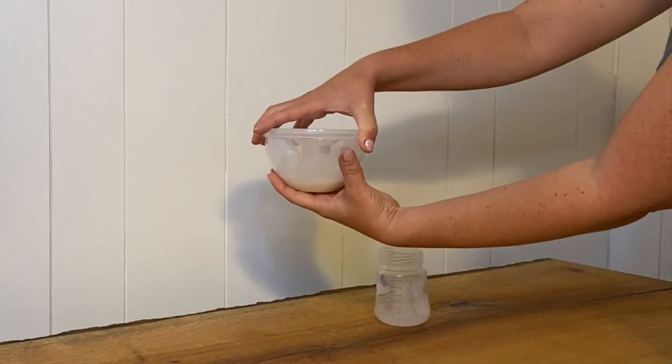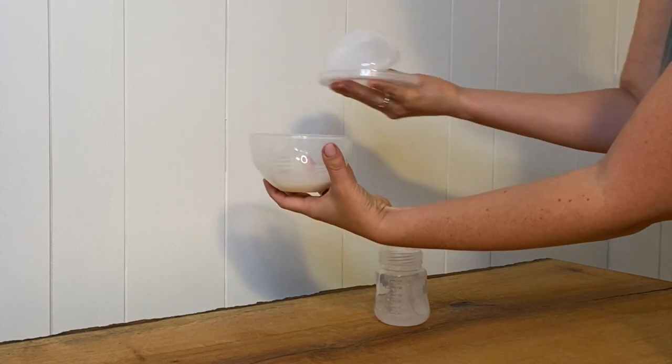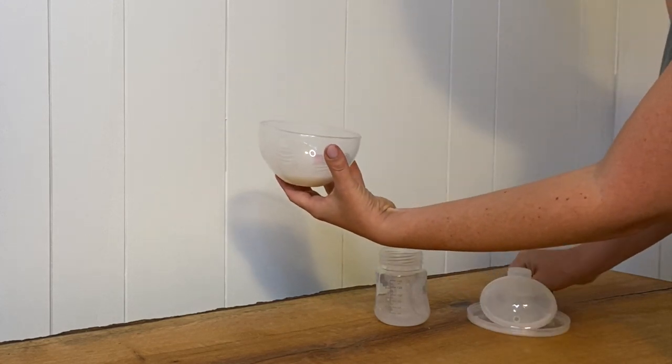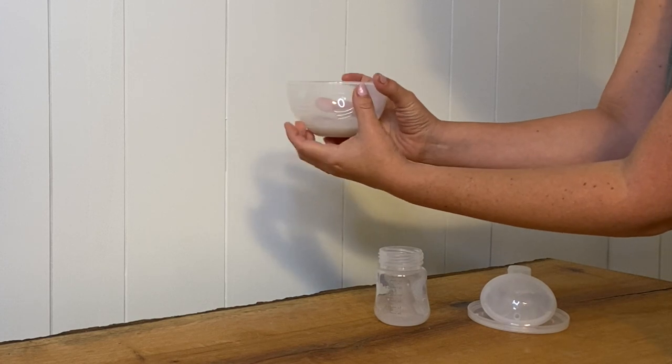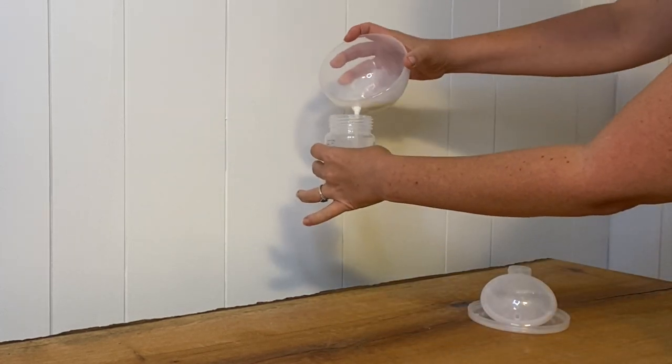So once you pump using the cups, you're going to carefully remove the cover and all the other parts, keeping it upright. Using this easy pour spout right here, you're going to pour the milk into the bottle — and that's it.